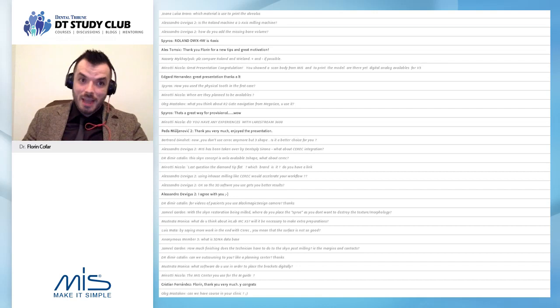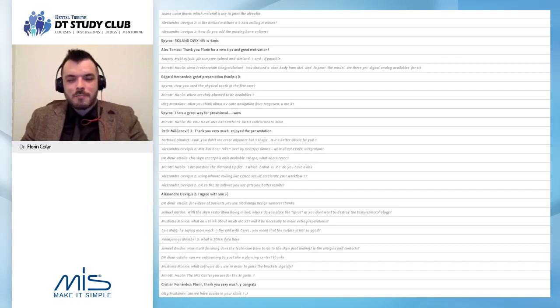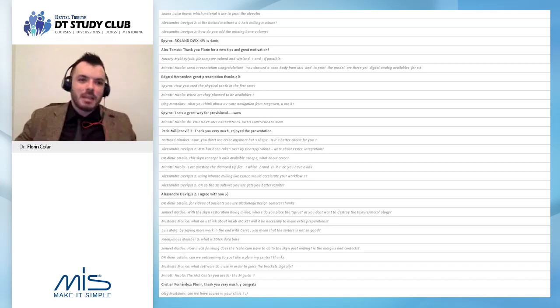And then there's the CAM, which is very important. In a closed system, you don't have the CAM. So if you don't have the CAM, you depend on whatever the company feels like changing next month. You don't know. When the next update comes in a closed system, it can be good, it can be not good, because sometimes you want something else and you get something completely different. It's a lottery. You lose control.